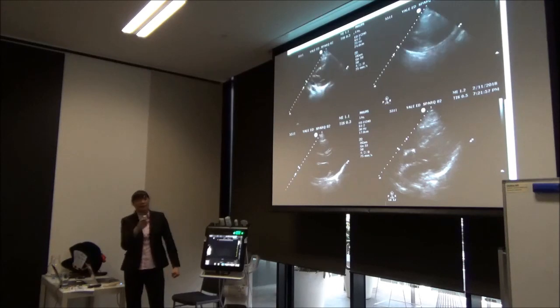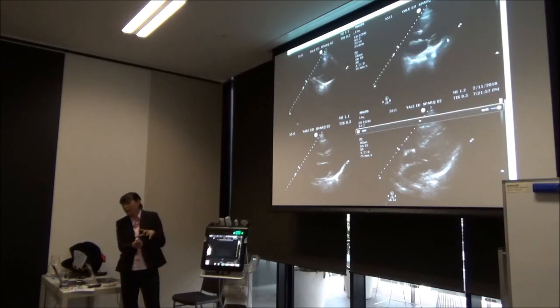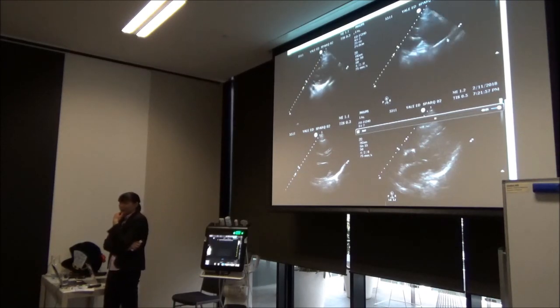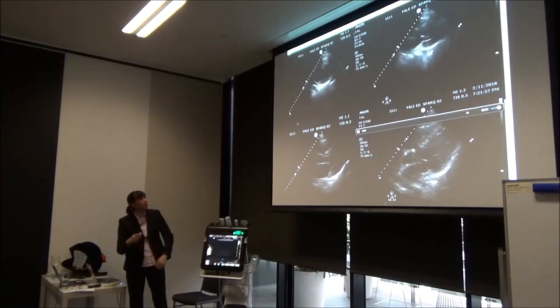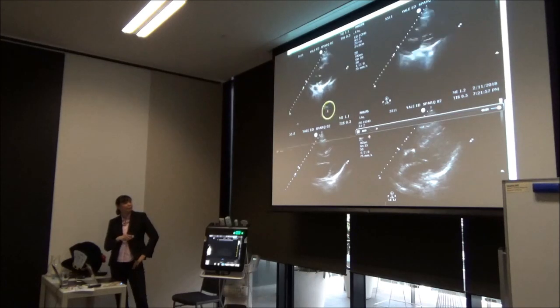Diagonal thing, at least now I'm getting some recoil and collapse of the LV. Can you guys see that, or is it really obscure? It does take some practice to look at these for a while. Okay, so we continue at ACLS, and after 3 pulse checks, we get this in the pulse check.